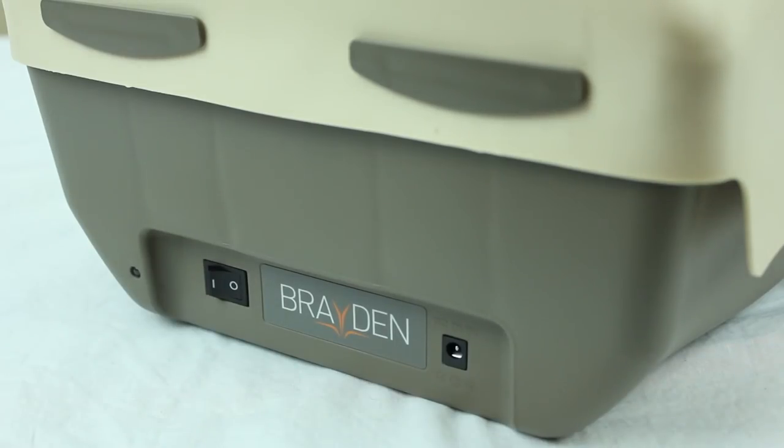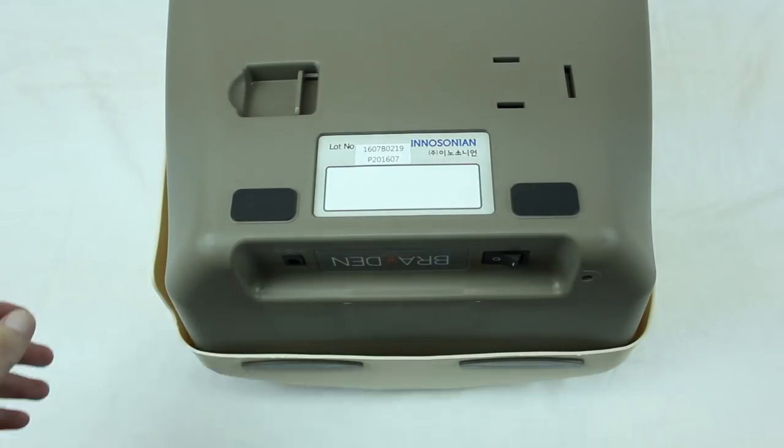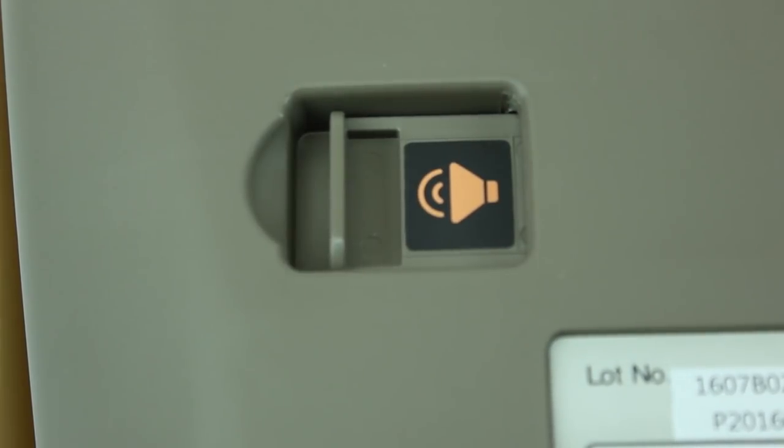After installing the batteries, turn on the mannequin and begin chest compressions. If you'd like to turn the clicker on or off, simply flip the switch located on the back of the mannequin.